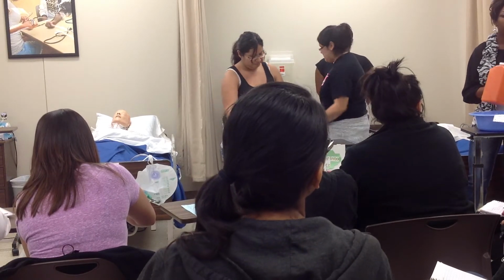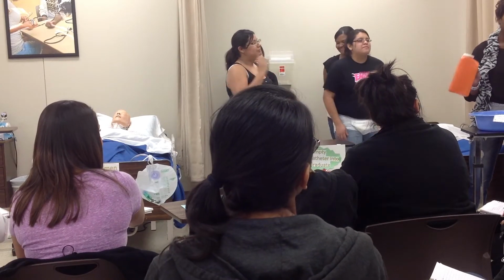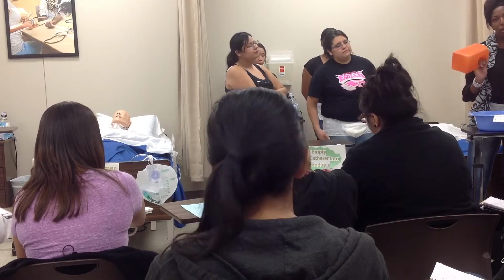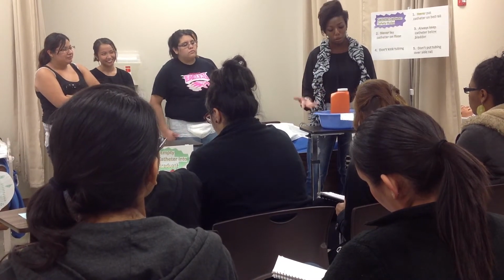Right after you tell them that, the next time they urinate, you don't take it. You take the next one, and then you have to take it for 24 hours. Tell them no feces, no tissue, it has to be straight urine. They can urinate somewhere else, like in a hat or in a urinal, but you have to get it in this, because this has to be placed in ice. And if they have a catheter, that also has to be placed in ice, and you'll have a tub like this full of ice that you'll have to change, keep it cold.